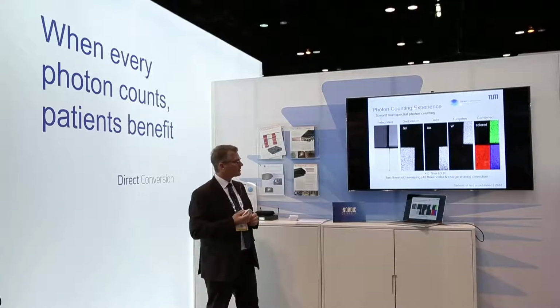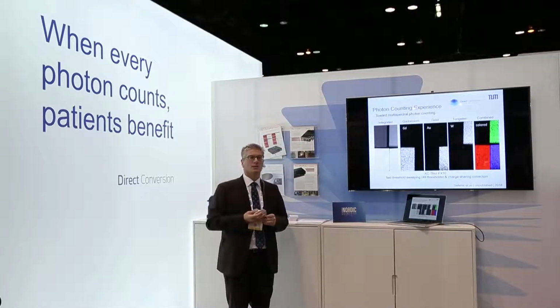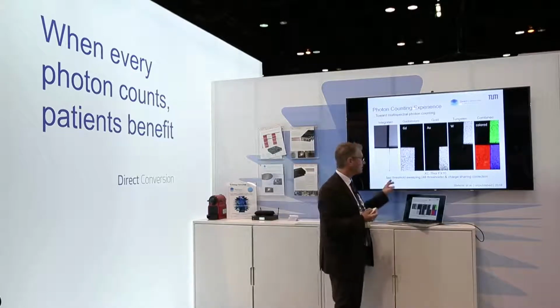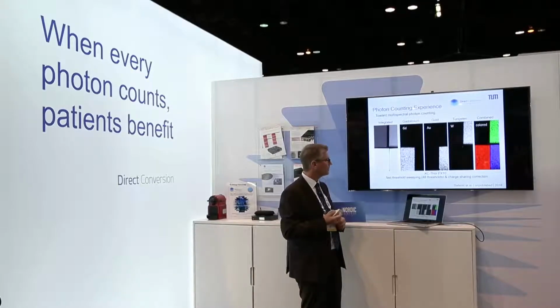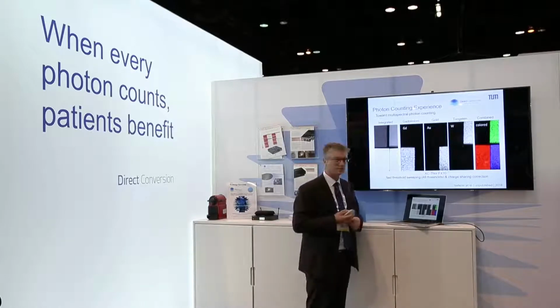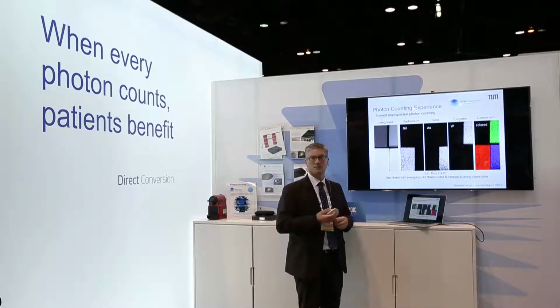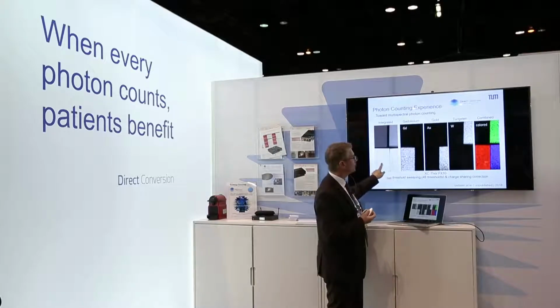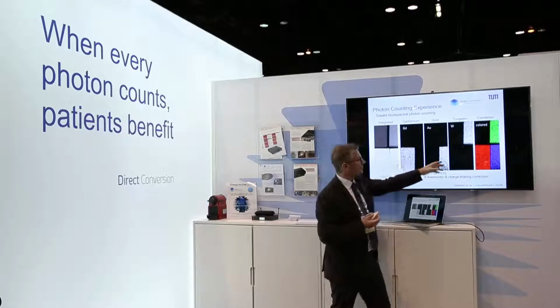Finally, that's a very recent result where we try to get even more energy bins, in this case by doing a fast threshold sweeping, which the detector can do. So we have about 48 thresholds theoretically, and then we can actually, coupled with charge sharing correction, do almost as many different materials as we want. Here you see, this is a gadolinium foil. You have gold here, you have tungsten here, and then you can of course color it in your different ways.